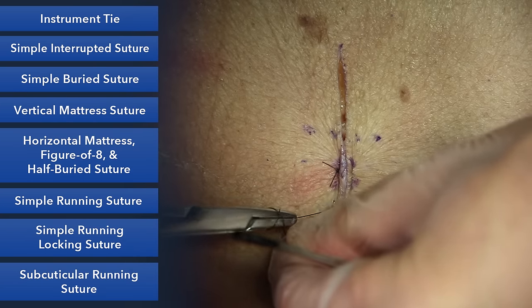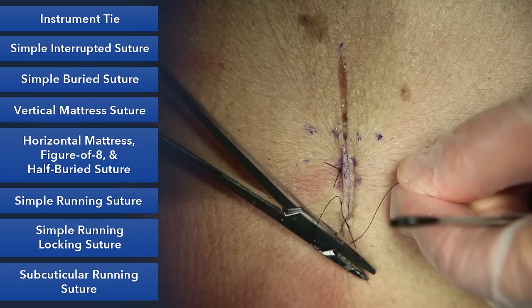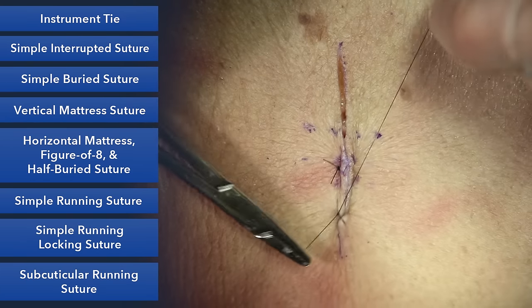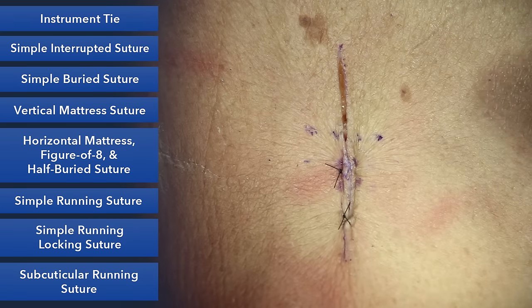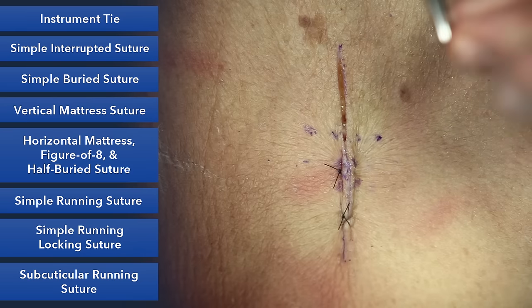Instead of doing two simple sutures and tying two simple sutures, you'll see this sometimes in some deeper closures, like fascial closures, because again, you're grabbing a bunch of tissue to a bunch of tissue, and therefore it'll be more secure. The final variant of the horizontal mattress is called a half-buried mattress.